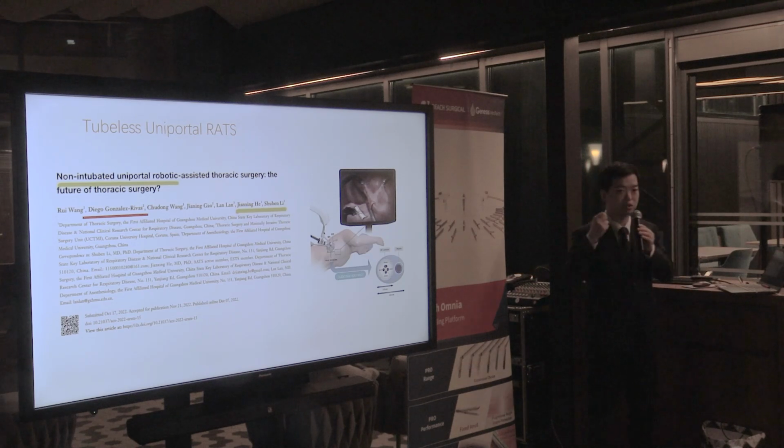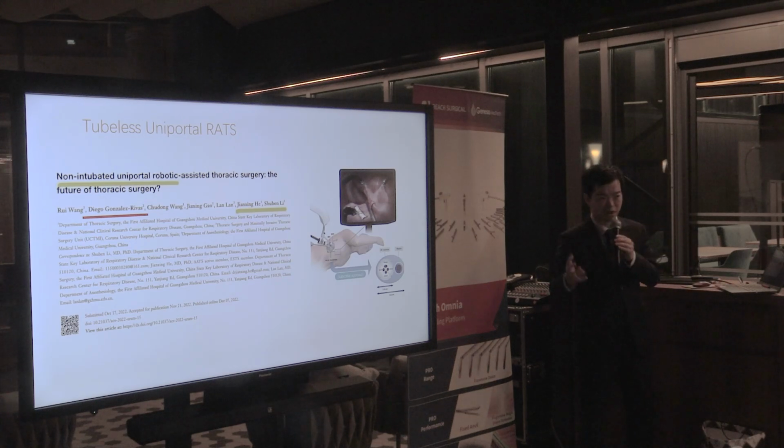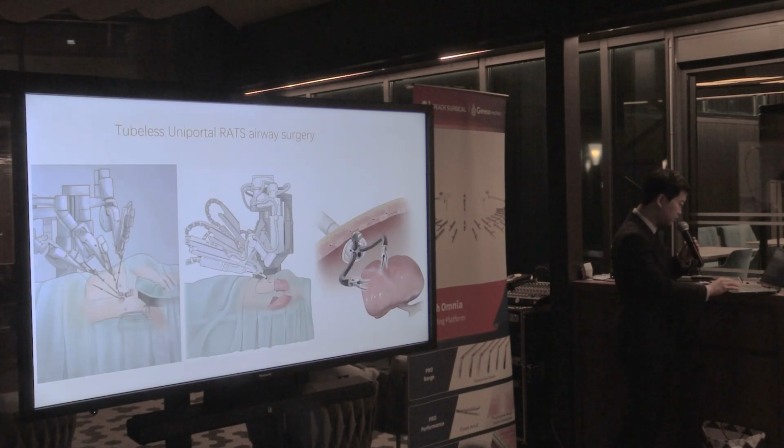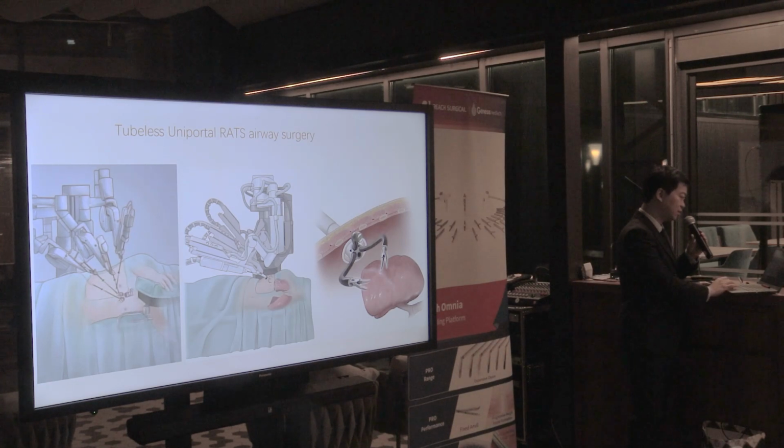However, in 2021 and in 2022, under the leadership of Dr. Diego Gonzalez, we also published some manuscripts focused on Uniportal. We should point out that non-intubated Uniportal robot-assisted thoracic surgery may be a new direction in the future. Just now, as I mentioned from Dr. Diego, we can see that this is Uniportal airway surgery, and this is Da Vinci.